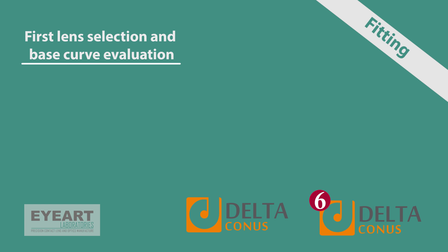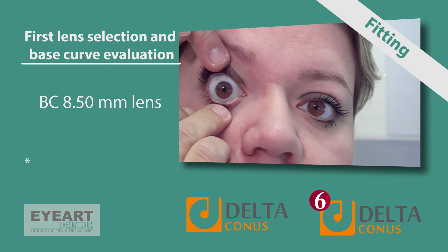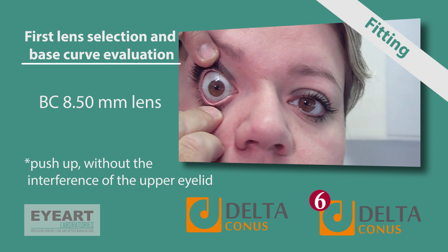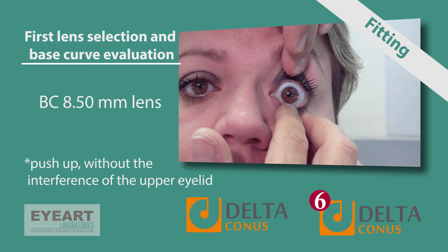A couple of simple points are essential in evaluating base curve selection. Always start with the 8.5 mm base curve lens in initial or moderate deformed corneas. Fit the lens and evaluate its movement and centration using the push-up method. When performing the push-up, observe the movement without interference from the upper eyelid — hold the upper lid open, avoiding it touching the lens.